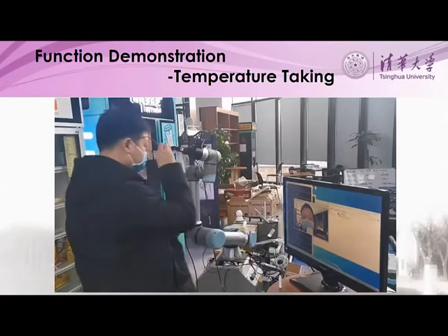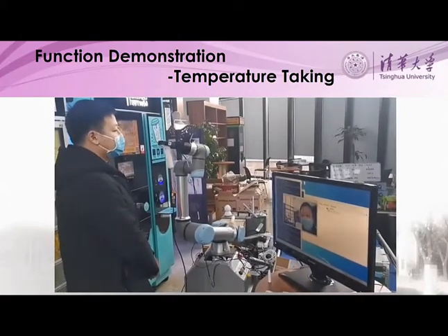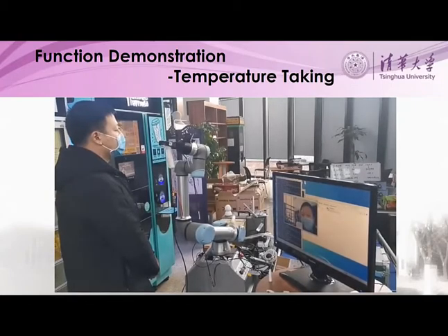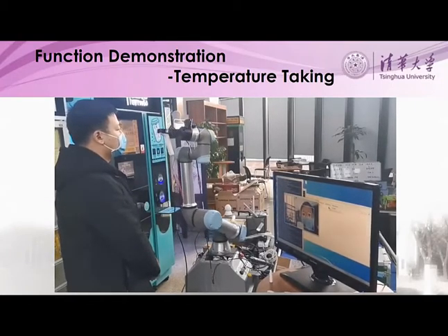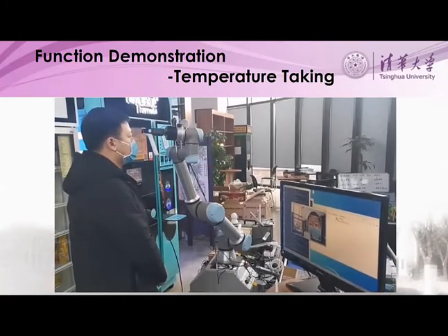Now, the team demonstrates the functional capabilities of the robot in a laboratory setting. First, temperature taking. The robot locates the face through computer vision, then using a non-contact infrared thermometer, takes a temperature.